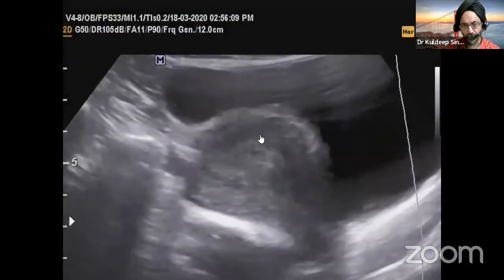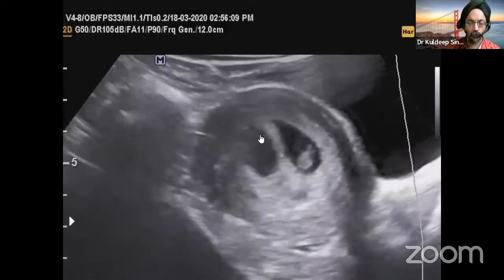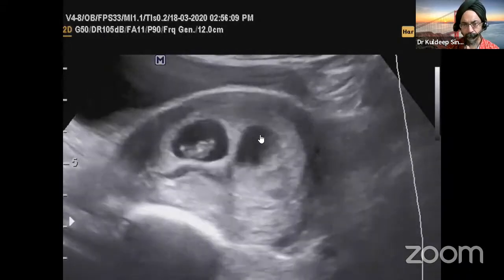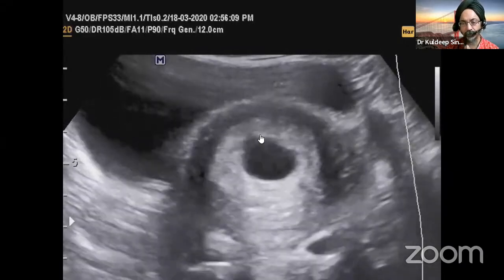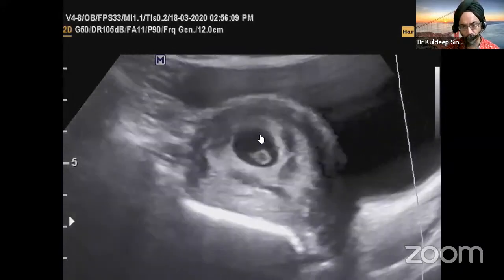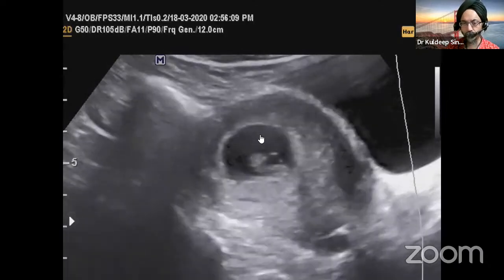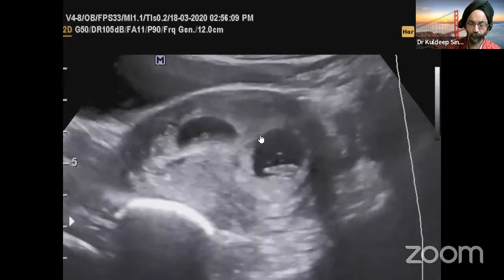If you're looking at this video, our basic thing is not to jump to what chorionic, what amniotic. No. The first thing is we're looking at gestational sacs, how many gestational sacs, and what information each gestational sac is giving us. That's most important. The other thing we need to be careful of, even if you're looking at gestational sacs in the uterus, please do not forget to look at the adnexa. There are chances there could be a heterotopic pregnancy.